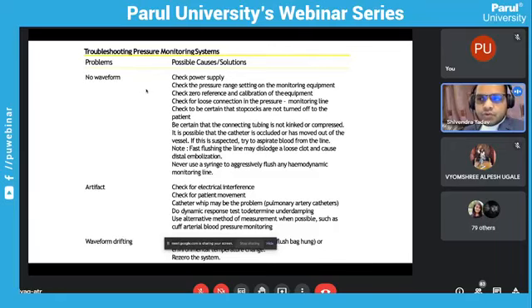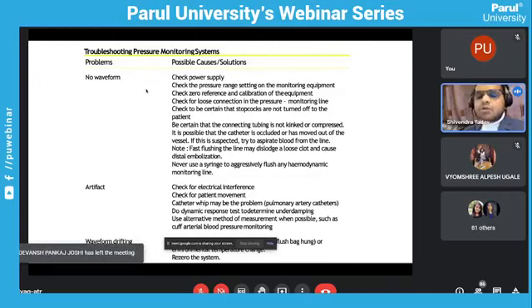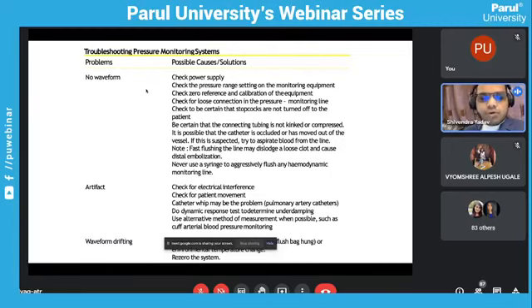Nowadays, when we do an intense procedure where the patient is in cardiogenic shock or the patient is on a ventilator, then he might have a lot of syringe pumps, a lot of medicines going on. Okay, these equipments will have electrical connections, and these equipments will cause electrical interference for our transducer. Hence, we should make sure that there is proper earthing, and that will solve your problem.